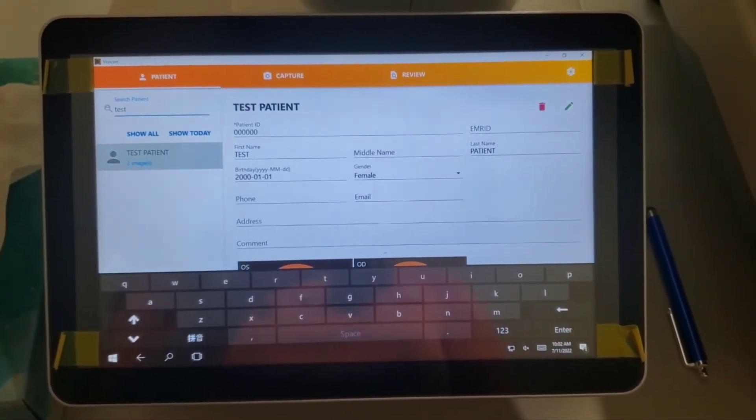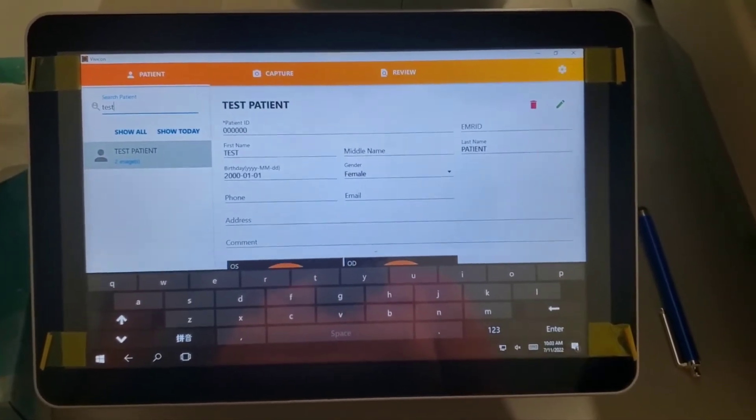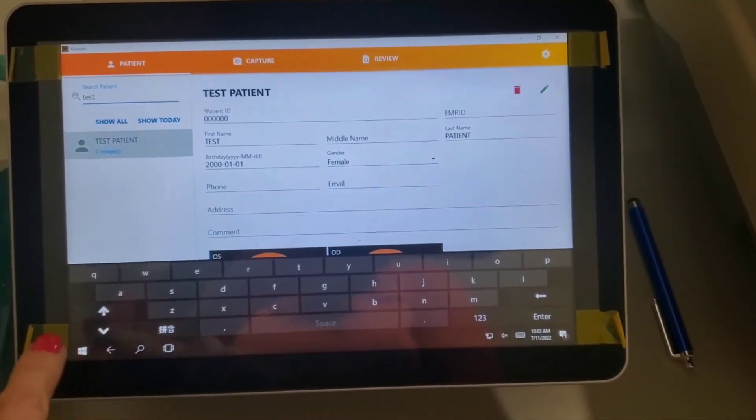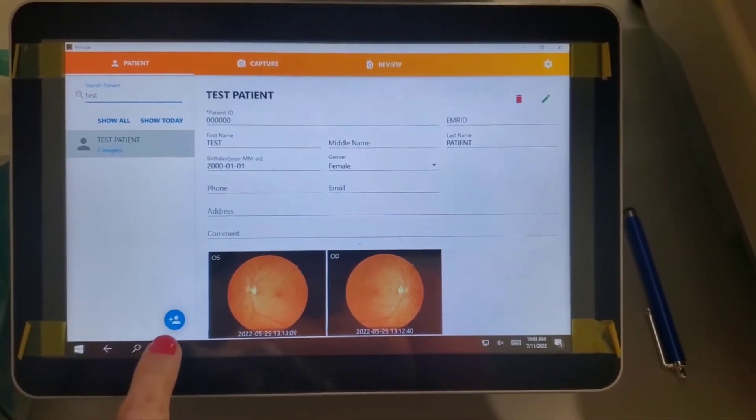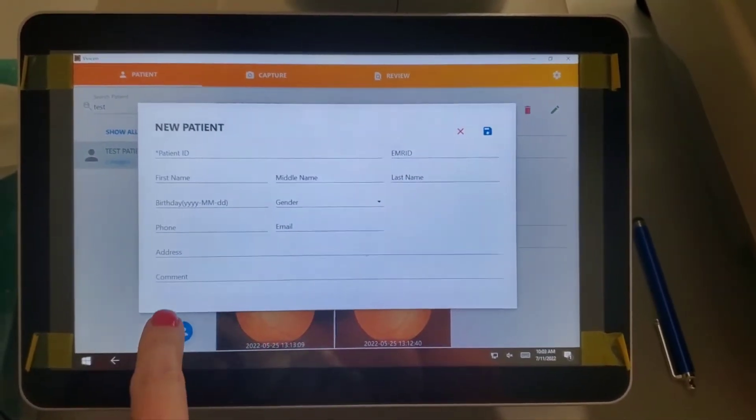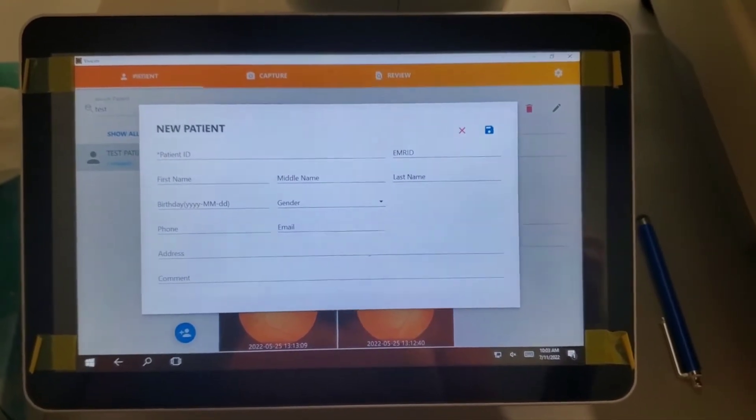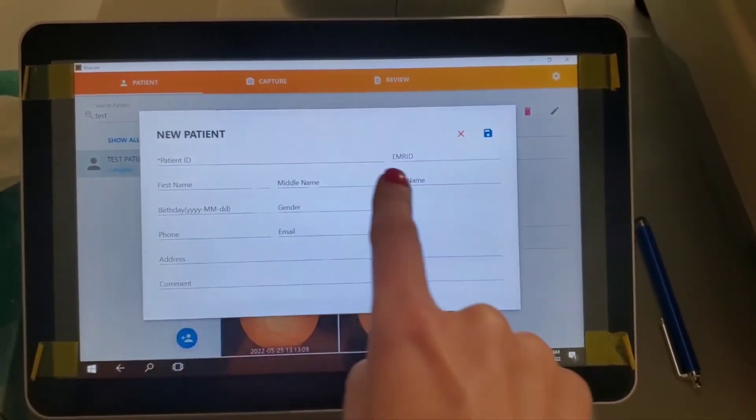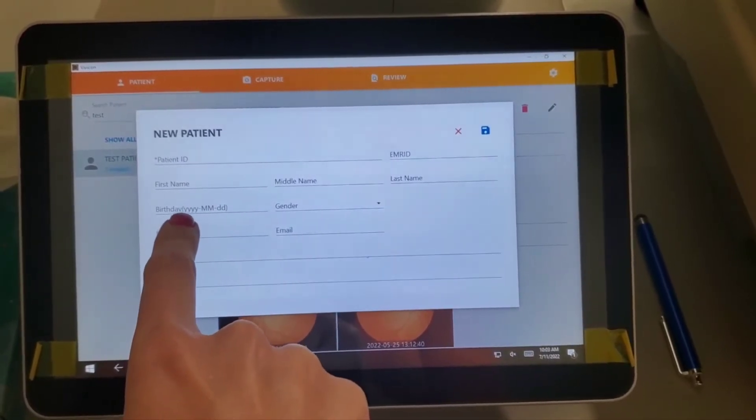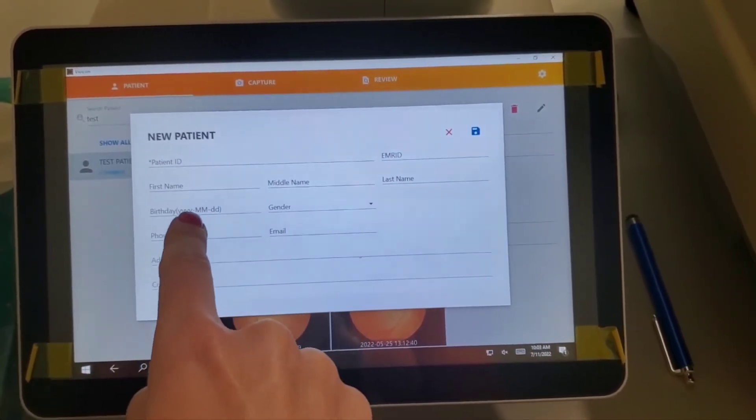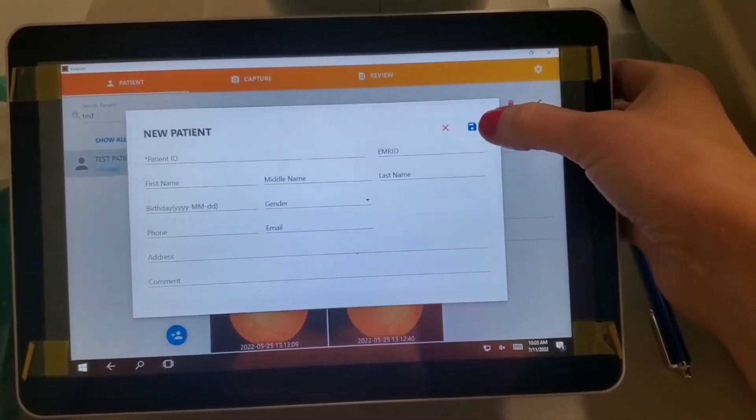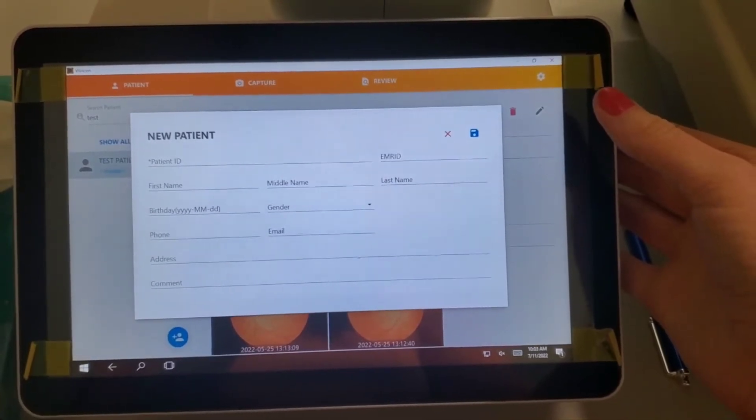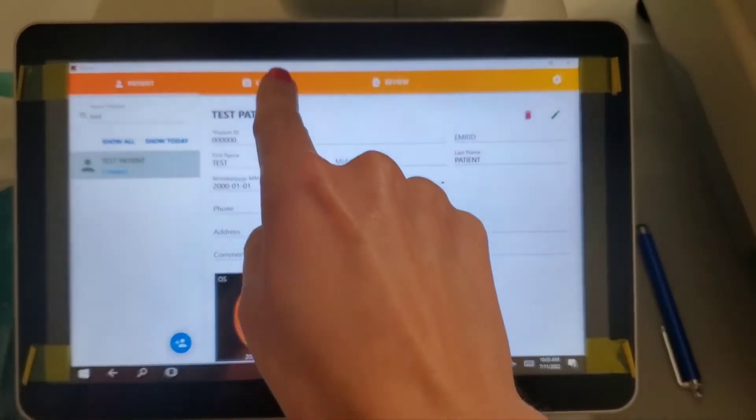But let's say that they're a new patient or they're an established patient who has never done photos before. We need to add them to the database. I'm going to click the down button to get rid of the keyboard for a second. Then there's a new patient button here at the bottom, the blue one. You will need the patient's ID number, which should be on their clipboard at the top. Then we're going to enter their first name, last name, date of birth. Now this one you have to put the year in first. That always messes me up. Do the year first and then the month and the date. Then do their gender. Then you would hit the save button here at the top, that blue button. Once your patient is added, they'll be selected and then we're going to hit capture.